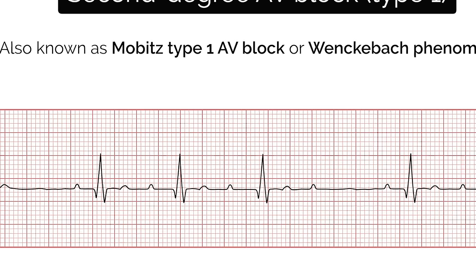T waves represent the repolarisation of the ventricles. Tall T waves can be associated with hyperkalaemia or a hyperacute STEMI. T wave inversion can represent normal physiological variation or underlying pathology. Isolated T wave inversion in leads AVR and V1 is normal. Other normal variants include isolated T wave inversion in leads 3, V2 and V3. New T wave inversion compared to a patient's prior ECGs should always be treated as pathological. U waves are not a common finding. The U wave is a greater than 0.5mm deflection seen after the T wave, best visualised in lead V2 or V3.